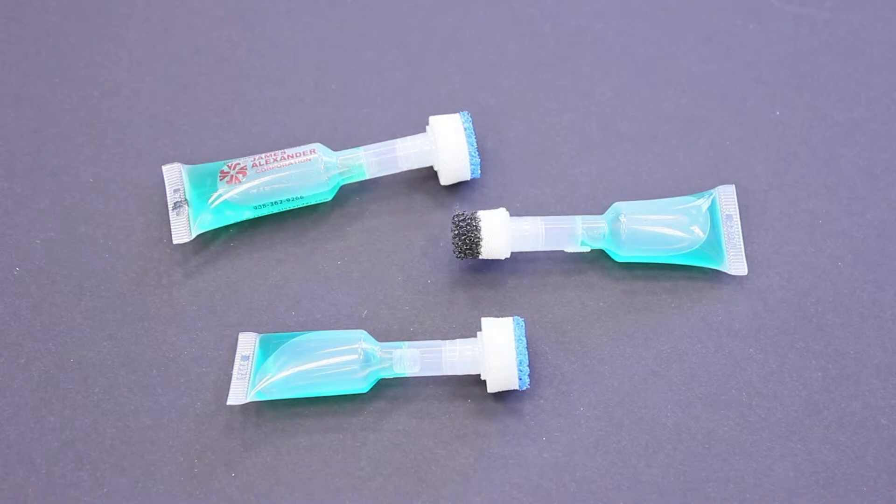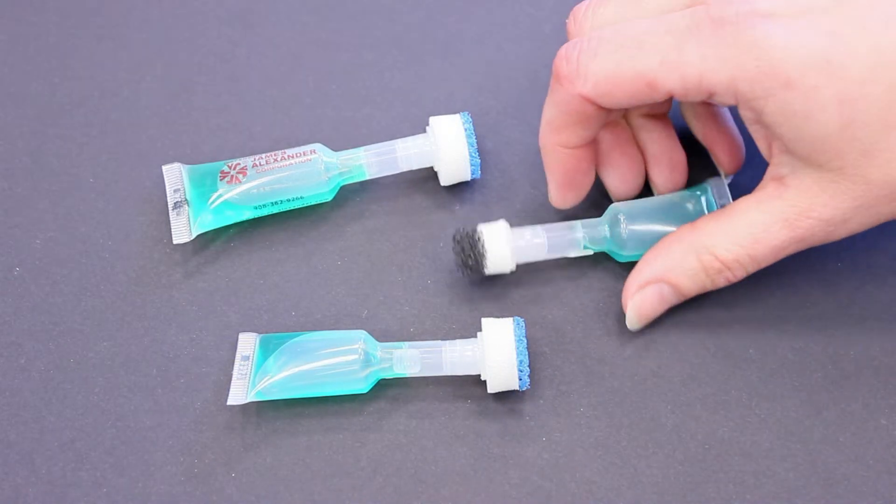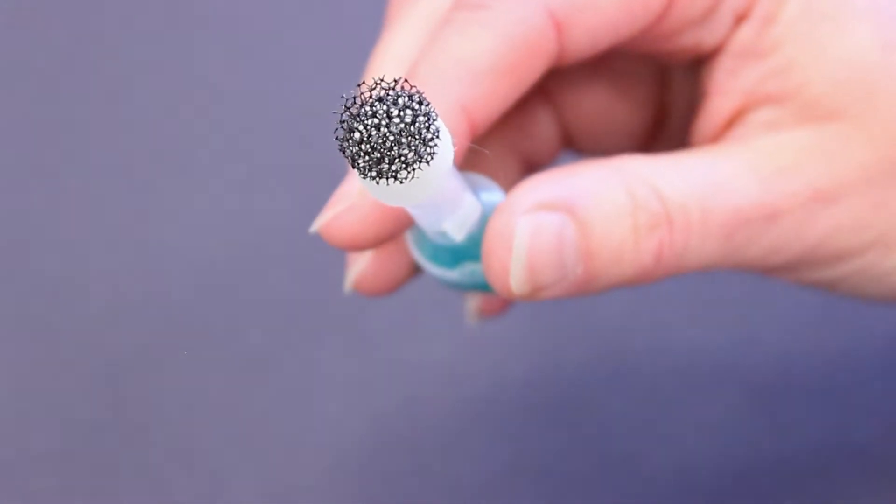James Alexander has a unique laminated foam applicator tip that fits on the two milliliter or five milliliter plastic ampule. The laminated foam tip is perfect for a scrubbing application.